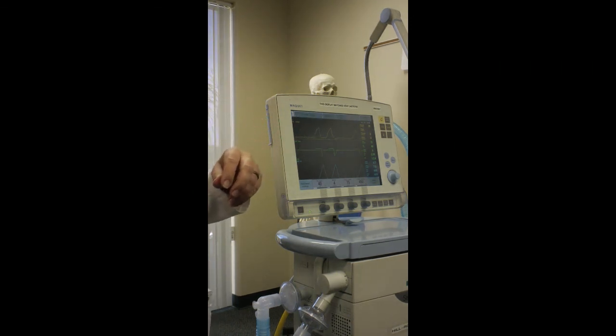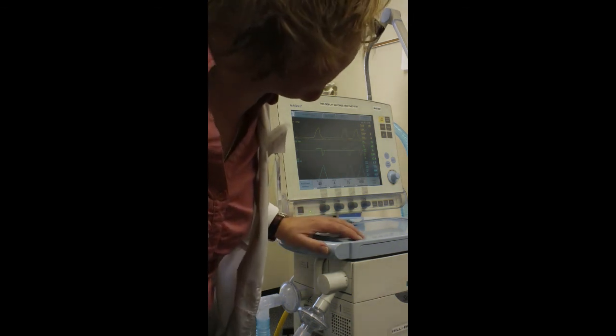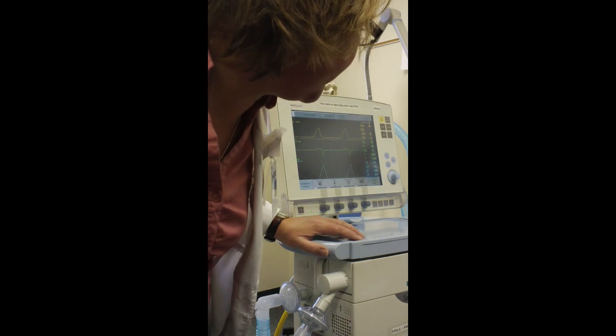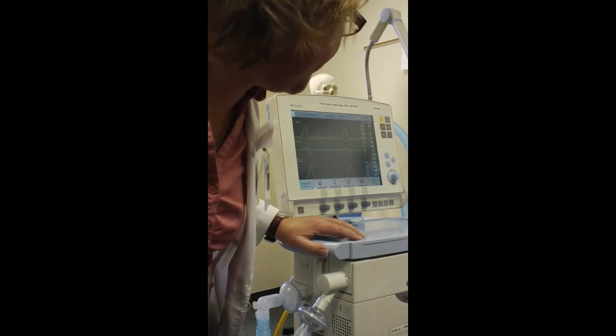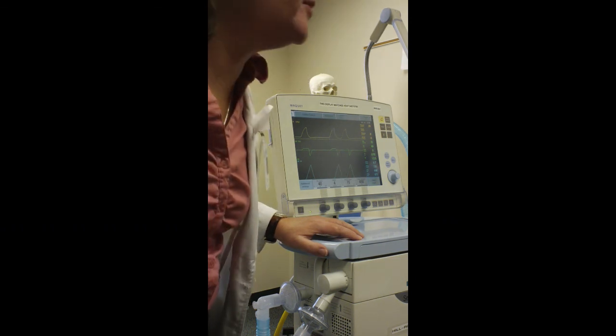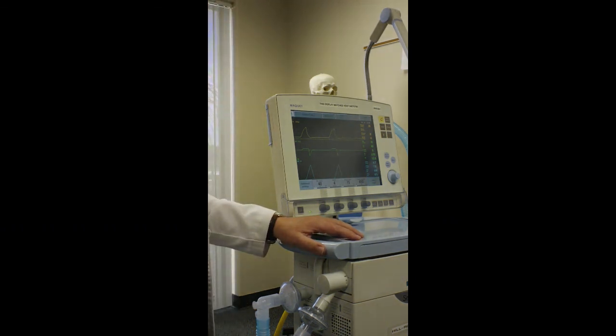So you'll take your exhale tidal volume and divide it by whatever your plateau and your PEEP is. So let's do this example. Our exhale tidal volume is 467. Our plateau was 27 and our PEEP was 4. Plateau was what again? Sorry. 27. And PEEP. And exhale tidal volume? Exhale tidal volume is 471.